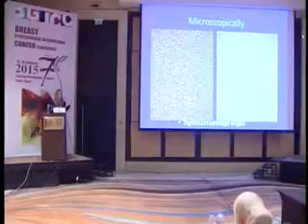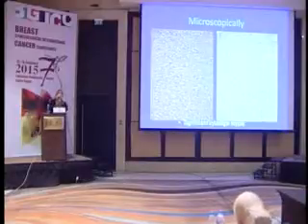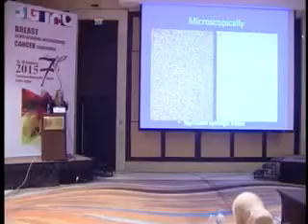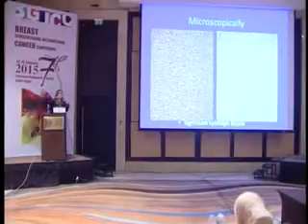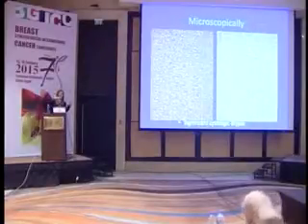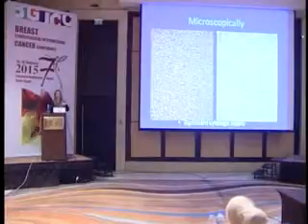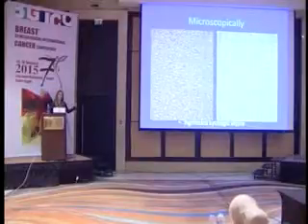The cutoff is 10. You don't have to count them. You have to look at them and say, yes, I have mitosis everywhere. And tumor necrosis. Tumor necrosis is the nightmare, I believe. Because if you have tumor necrosis with one of the others, you got the diagnosis, leiomyosarcoma. You don't have to have the three. Necrosis is very important, but it has to be coagulative tumor necrosis.